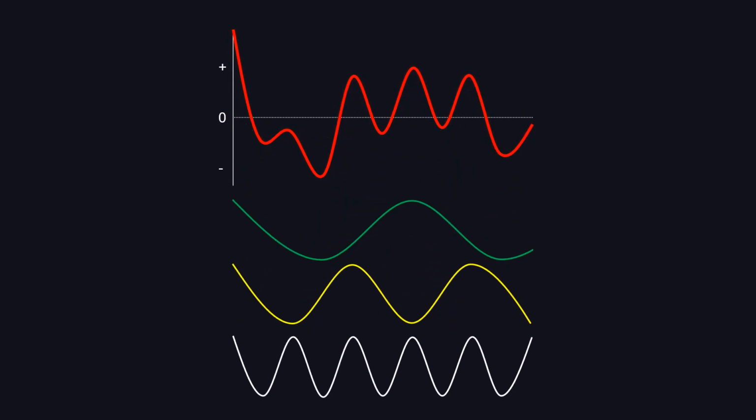Luckily, your brain has the ability to tease component signals out, and you are able to separate where the signal is coming from. So this complex wave can also be broken down into component signals. This process of decomposing a function into its constituent frequencies is called Fourier transform.